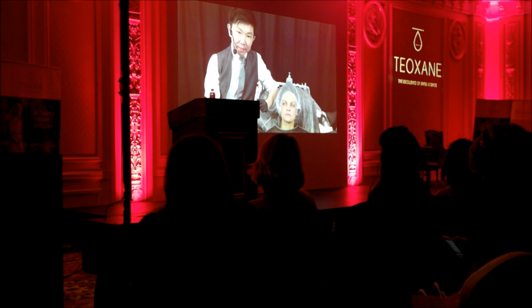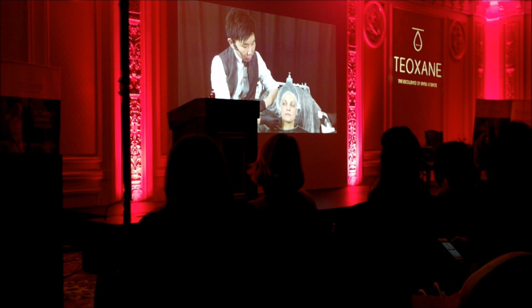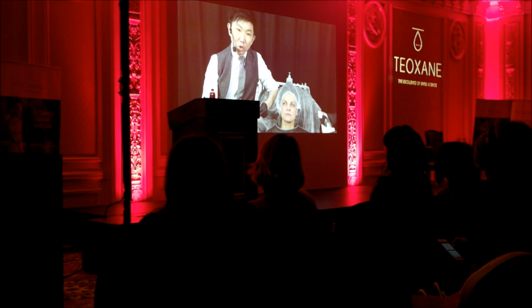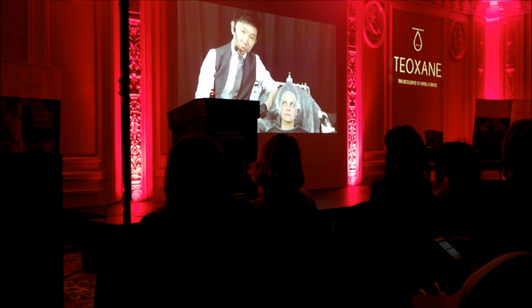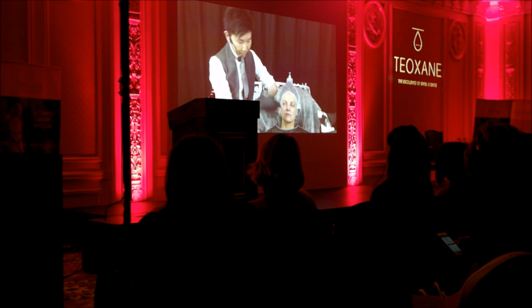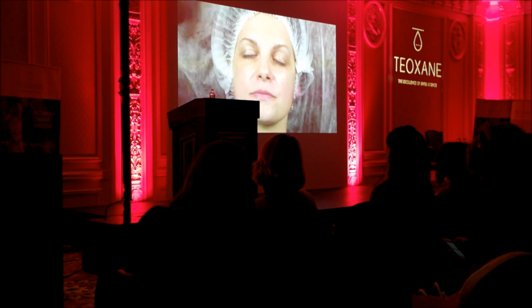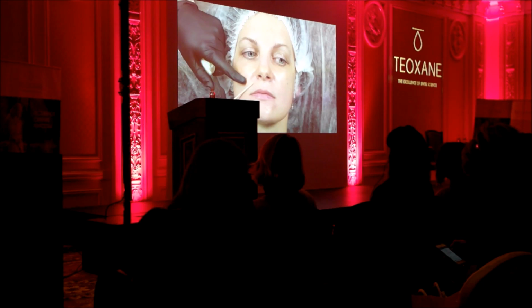So we've got Aksana. Aksana is not bad, right? She's got normal length white lip and reasonably normal volume in the red lip. So she is a reasonably good candidate. However, if you look at the side of her mouth, her lips here, she's got lengthening forward. All right, so camera, zoom out, excellent.